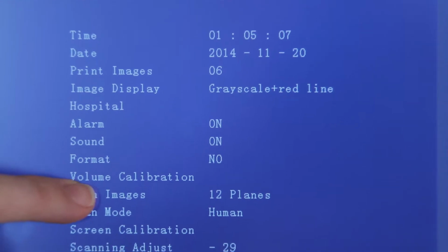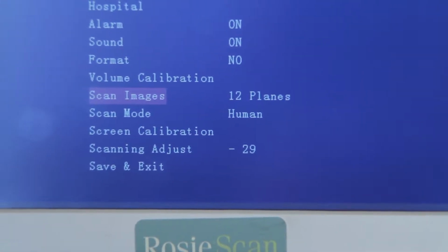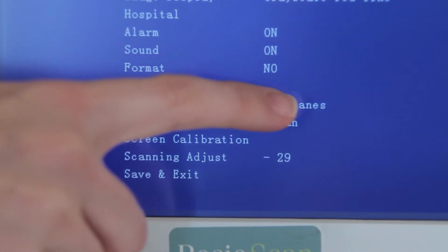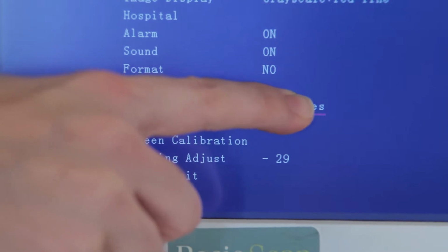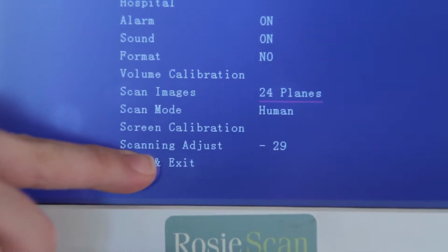You can touch the screen to select features you need to change or use the directional keys on the control panel. For example, touch Scan Images to choose between scanning 12 or 24 images. You must click on Save Exit in order to save your changes and go to the pre-scan screen. You are now ready to scan.